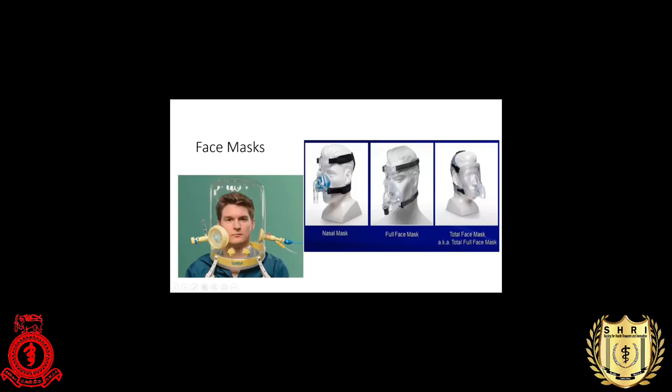If you use a proper mask, that will prevent unnecessary leaking, and you can give the patient your target setup. And before starting this, you have to explain to the patient what you are going to do, otherwise the patient will become very anxious and it will not be helpful.